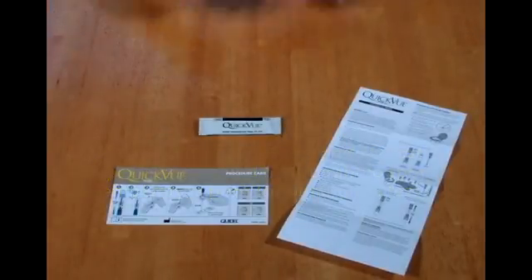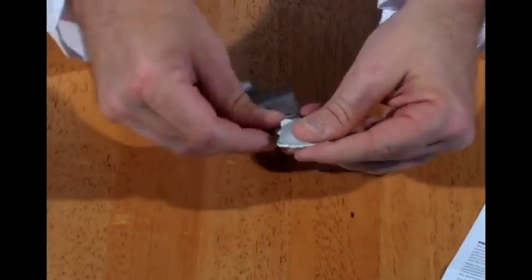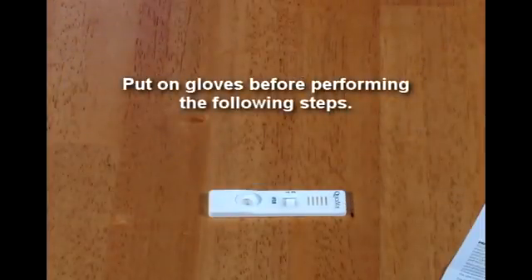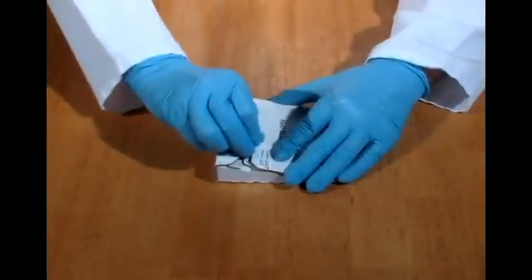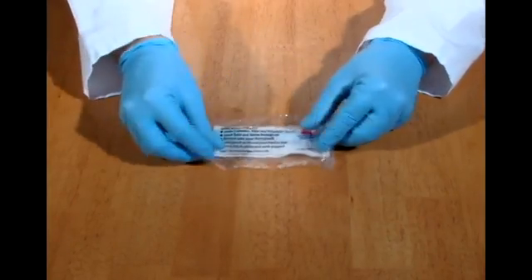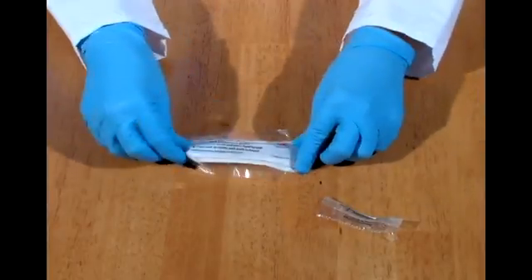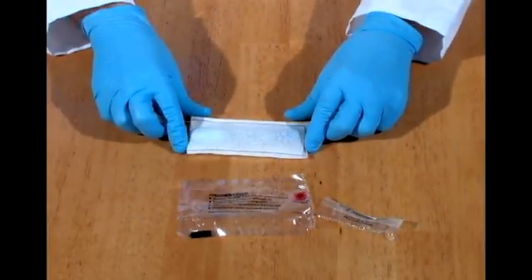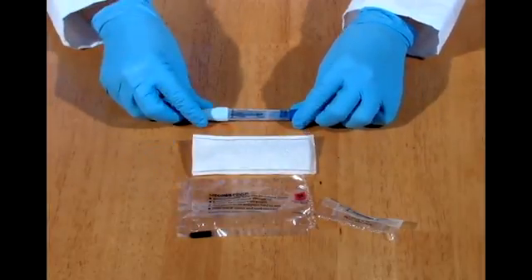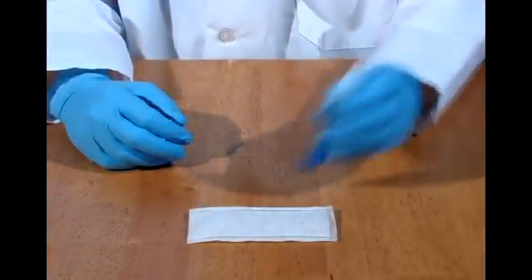To run the test, remove the test cassette from the pouch and place on a clean, flat, dry level surface. Put on gloves before performing the following steps. Remove from mailing box if applicable. Remove absorbent sleeve from specimen pouch. Remove collection tube from absorbent sleeve. Shake the collection tube to mix the specimen and the FOB buffer.